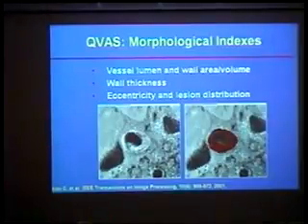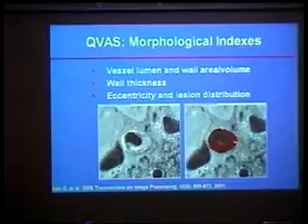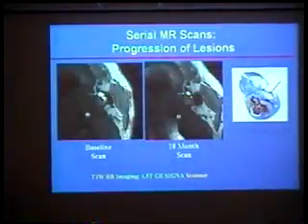Once this becomes an arbitrary shape, the thickness measurement becomes pretty much undefinable, especially if the lumen is of some kind of funny shape, not circular or oval at all. But this algorithm can handle all these cases to give you an answer that is in agreement with what a human would agree upon. So I think it's a pretty nice thing to have.